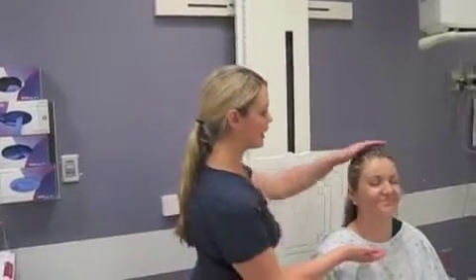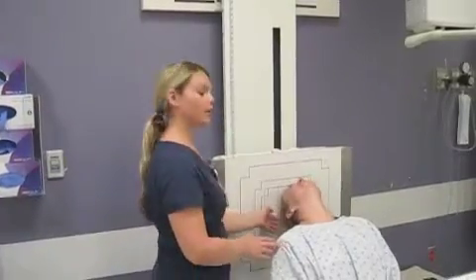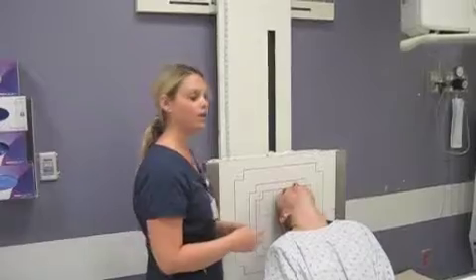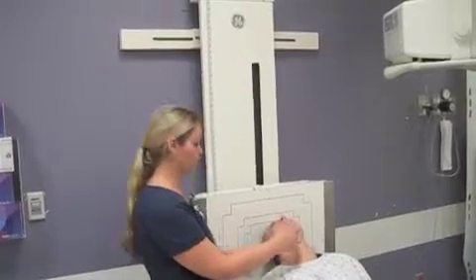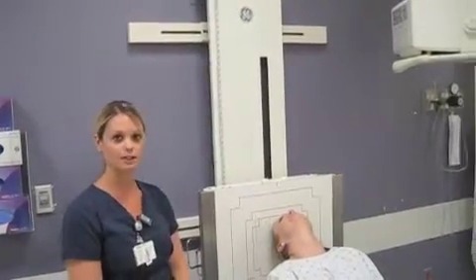Okay, now we're going to do our SMV view. So she's going to lean her head back. The vertex of her skull is going to touch here. Her IOML is going to be parallel to the IR. The central ray is going to enter 3/4 inch anterior to the level of her EAM. And the tube is going to be perpendicular.